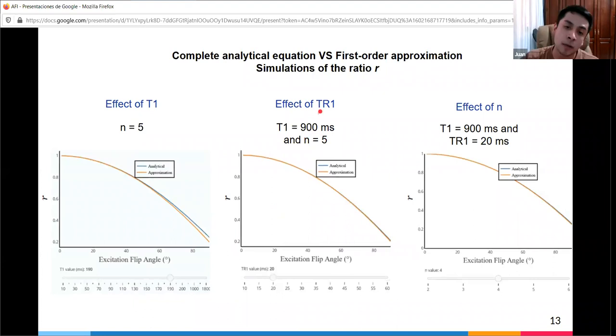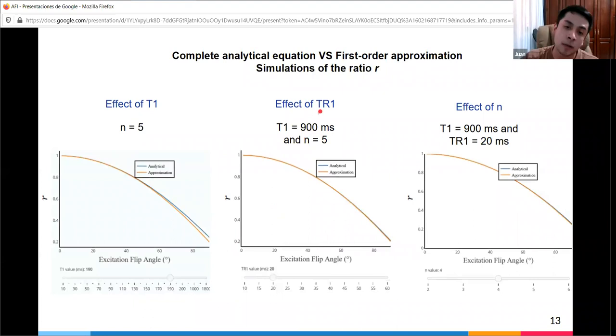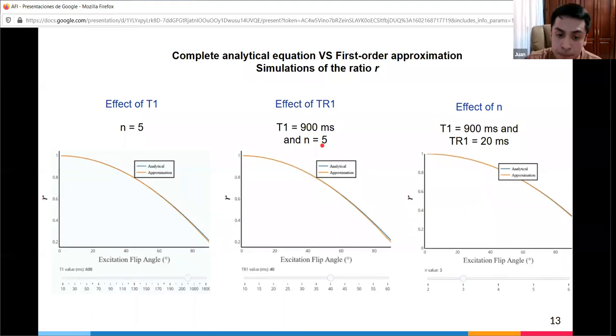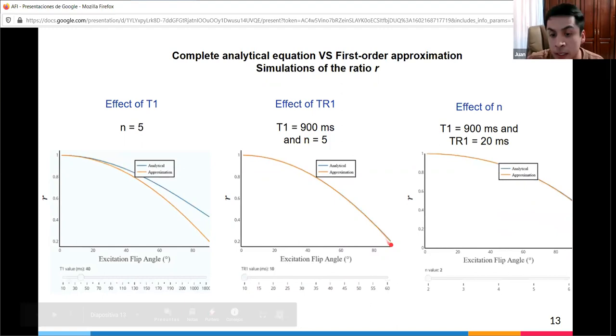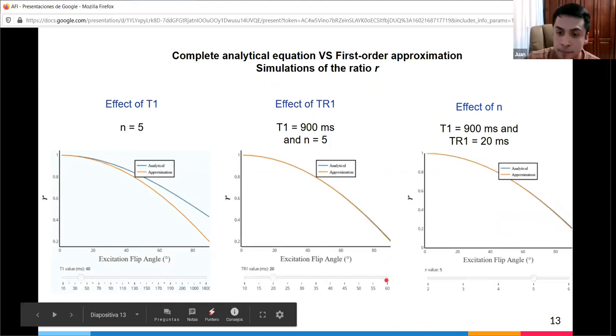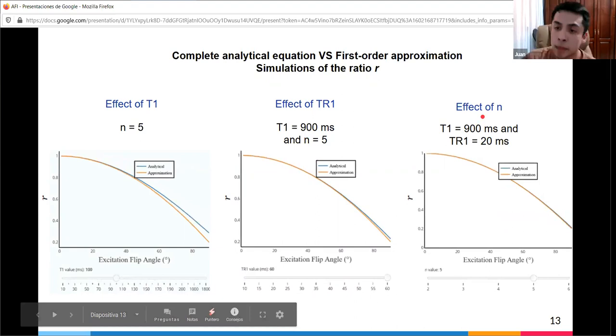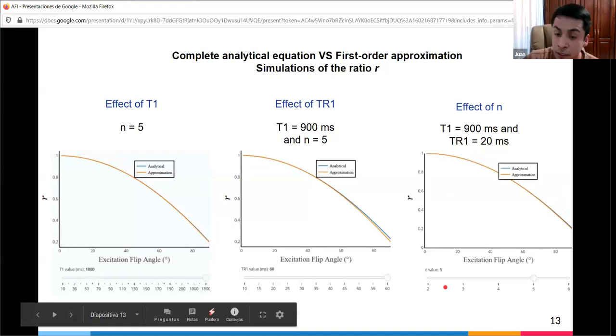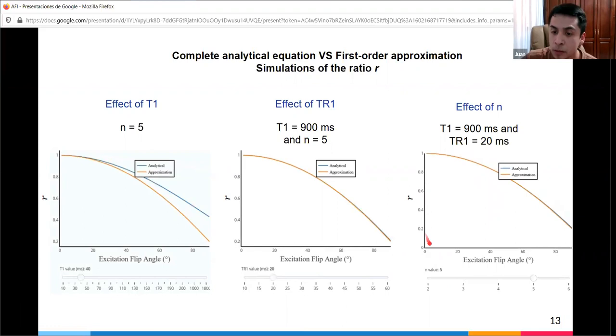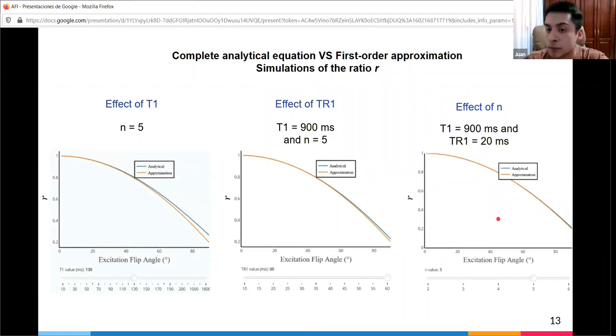To study the effects of timing parameters, they fixed T1 to 900 milliseconds and ratio n to 5. The user can change repetition time 1. There's also slight deviation from analytical and approximation at high excitation flip angles and long repetition times. The effect of ratio n shows that n is the main parameter affecting AFI method sensitivity. If they increase n, the variability of r increases for a wide range of excitation flip angles. However, they cannot increase ratio n without limit due to scan time constraints.